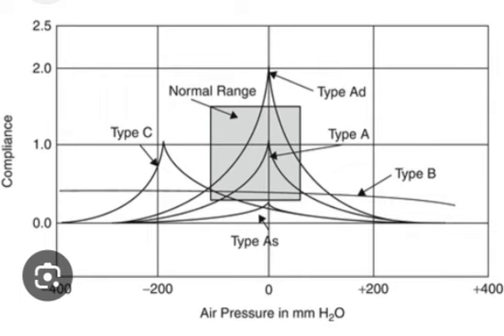In infants under 4 months of age, research has shown a 1000 Hz tone yields more accurate results. Multi-frequency tympanometry is conducted at multiple frequencies between 250 and 2000 Hz and is used to help identify ossicular abnormalities. Admittance is how energy is transmitted through the middle ear.